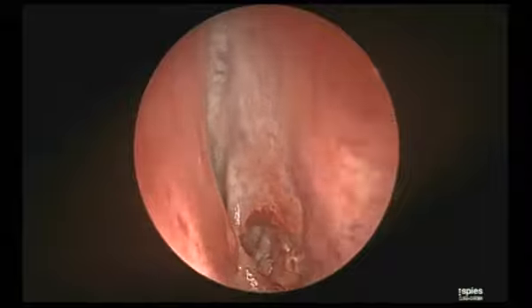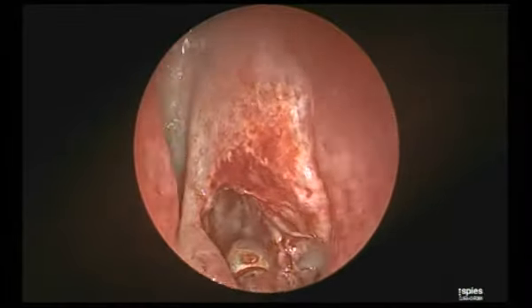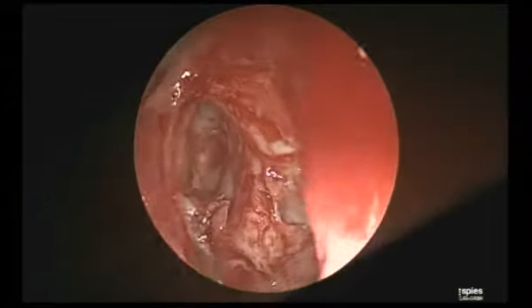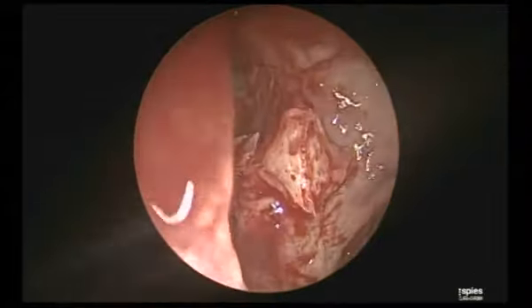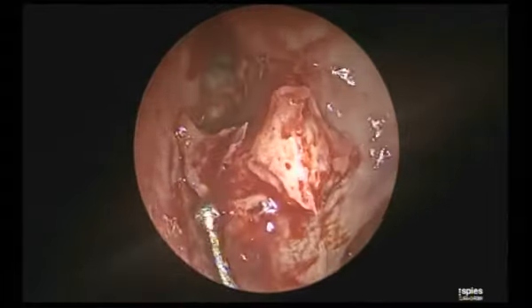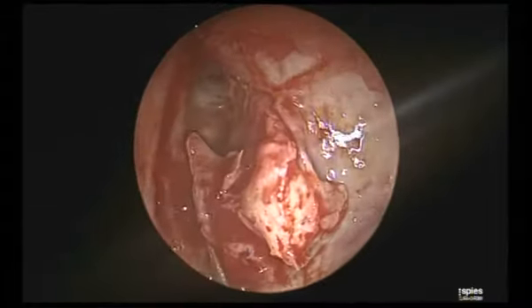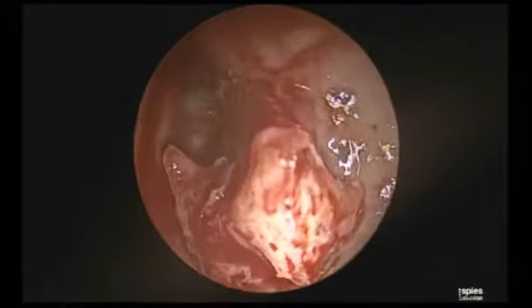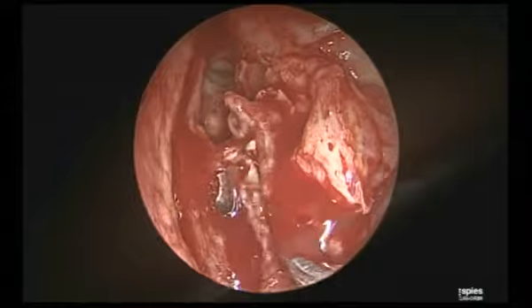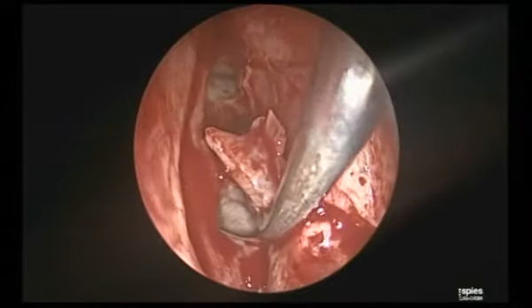Can you see? Now this is where he's changing. Again, this is something he has brought. He's going to do the next steps of the bulla removal also with the 70. See now why I was preserving the bulla, assuming that my artery will be protected by the bulla. Now if I go behind with the ball probe, see how the bulla is removed. Go behind the bulla, retrobullar, as superiorly as possible.